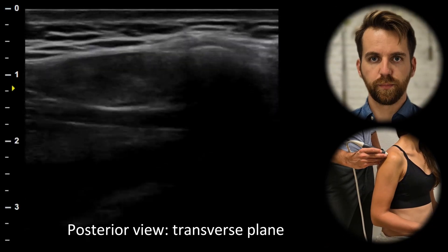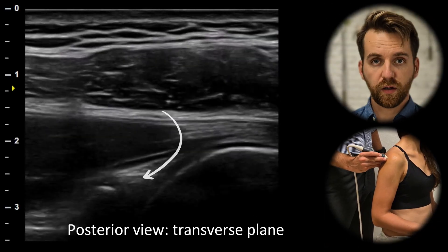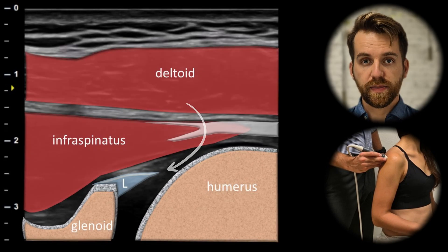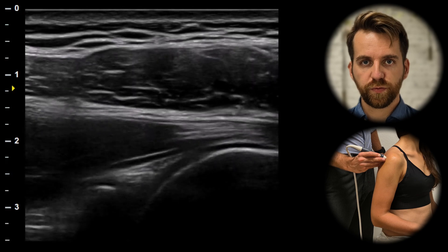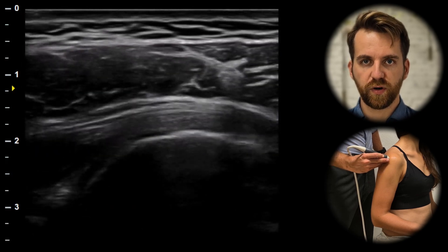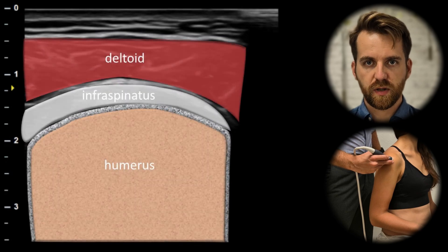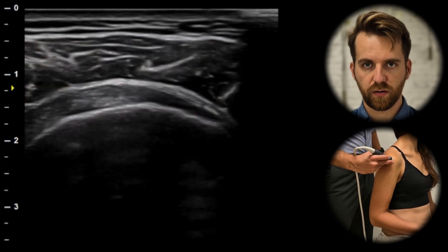The last view is the posterior view. Here we can identify the glenohumeral labrum. This is the second place where we look for the accumulation of intra-articular fluid. Superficially, we can see the muscle belly and the tendon of the infraspinatus muscle, inserting to the greater tubercle.